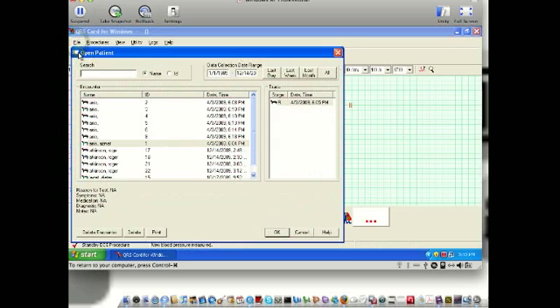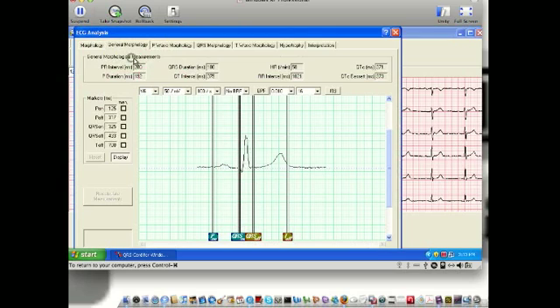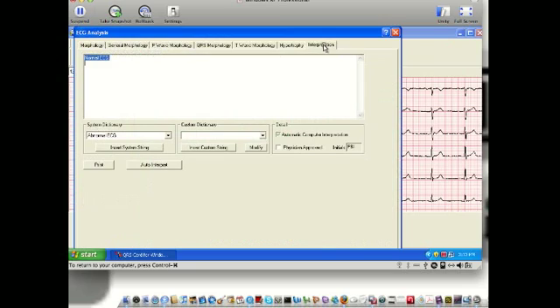Let's go look at open trace. And you were — what were you earlier? 22? Yeah. Look at that. Look at the interpretation — it is a normal EKG.